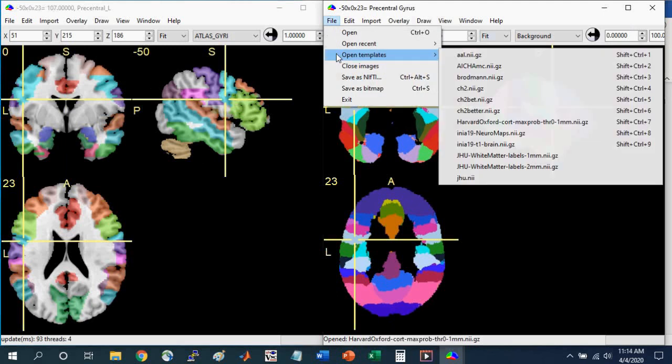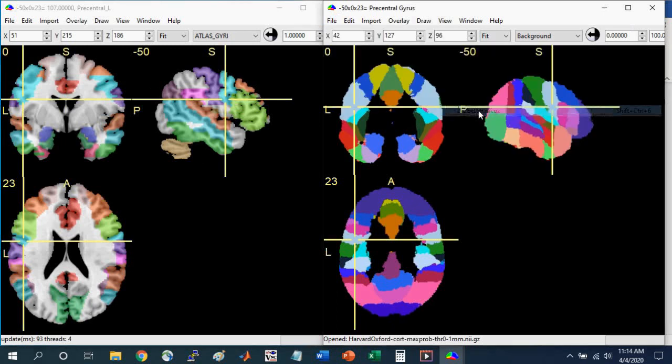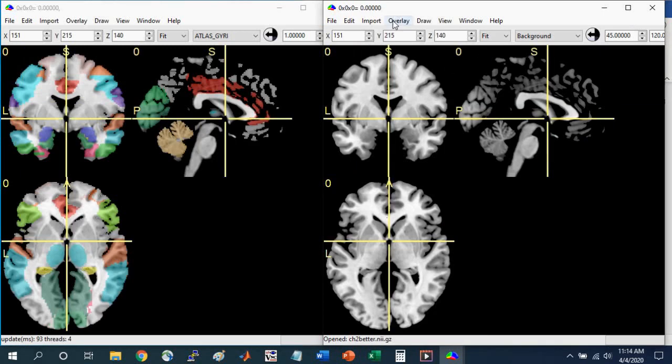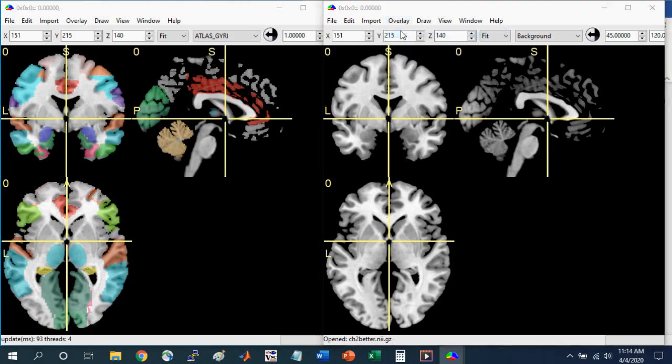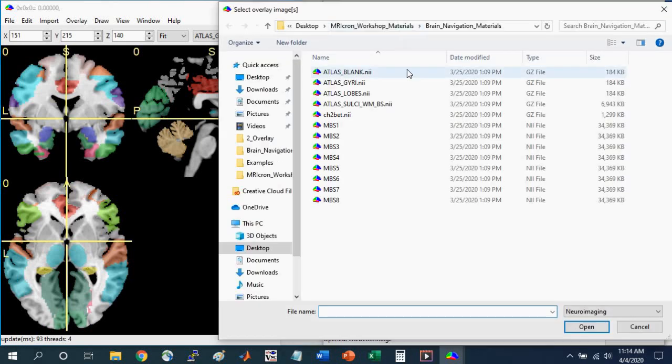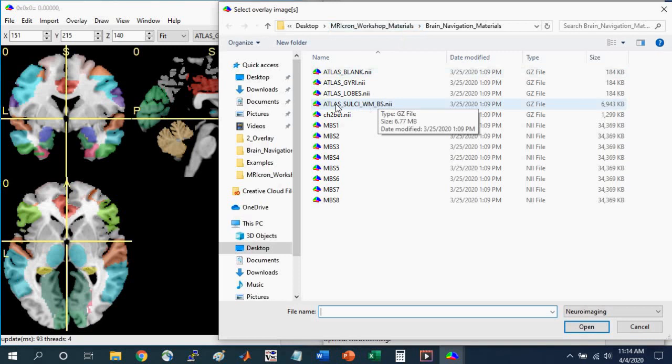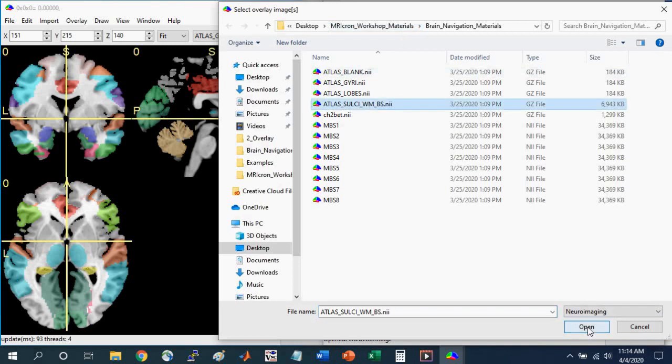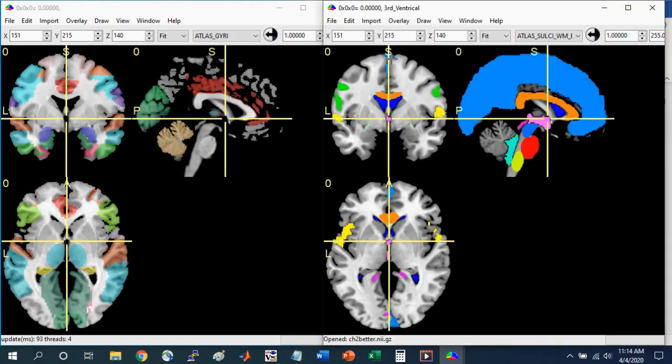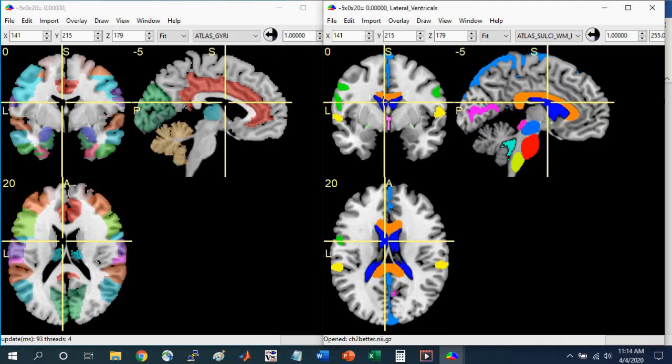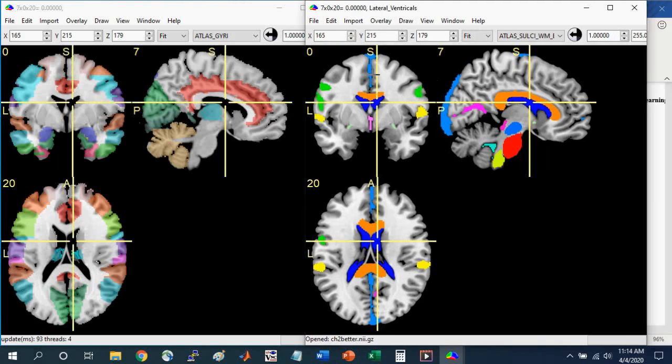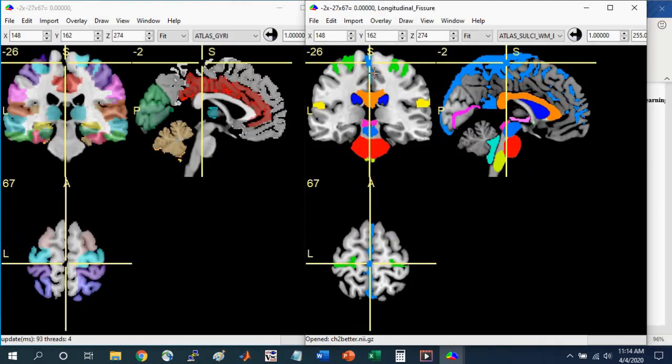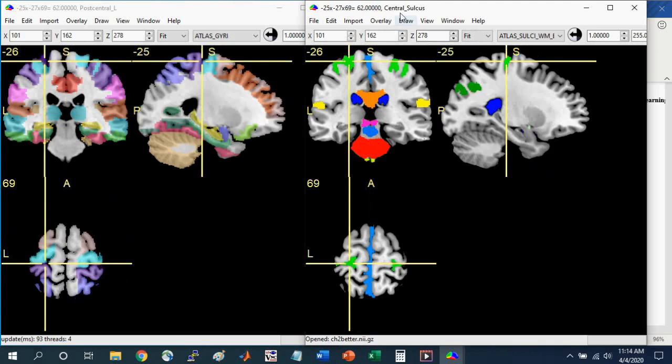I'm going to open the template again. So go to open template CH2 better. I'm going to overlay add, and I'm going to add the last atlas that has labeled structures in it, called atlas sulci WM for white matter, BS for brainstem. Click open. We'll see that this has different structures than what you see in the gyri atlas. This has the ventricles labeled. Here in blue are the lateral ventricles. It has the sulci and fissures labeled. Here's the longitudinal fissure. Here in green is the central sulcus.